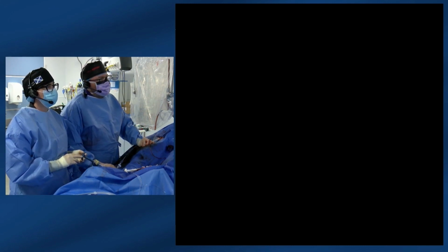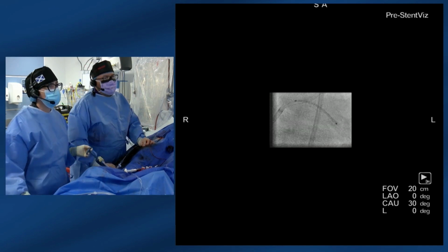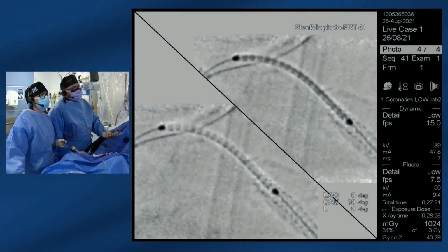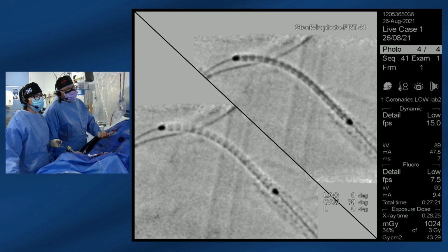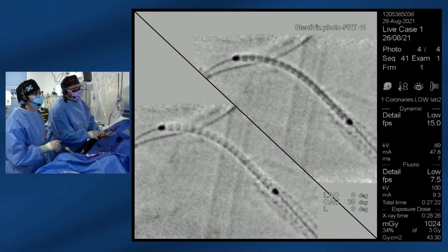Okay, so stent viz on. It's a 30 frame acquisition. Lovely, you can see there a really nice image where you can see we're nicely overlapped with the circumflex. You could even creep the stent back a bit, probably, a dot back. What do you think? I think so. Just to make sure we've got enough room for our pot, as you say.